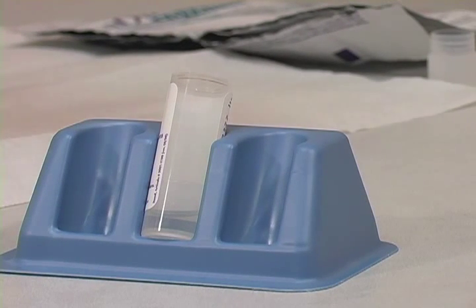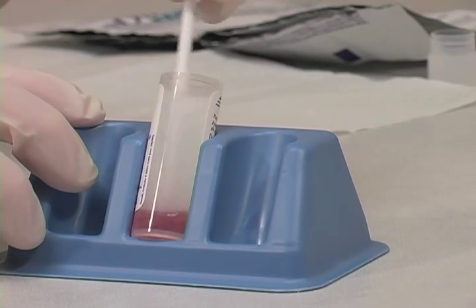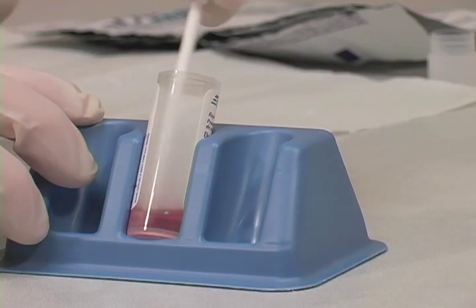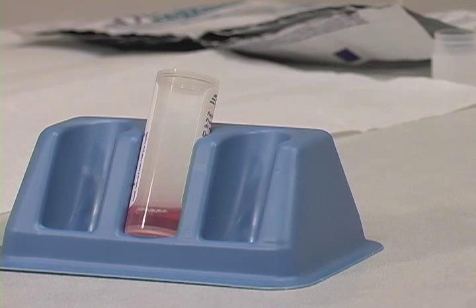Immediately insert the blood-filled end of the loop all the way into the vial and use the loop to stir the blood in the developer solution. Remove the used loop from the solution. Throw the used loop away in a biohazard waste container.